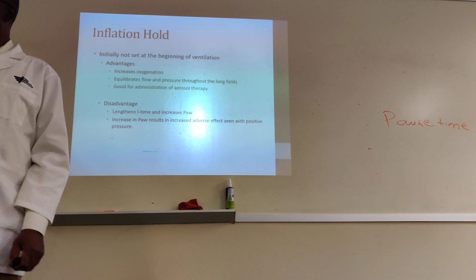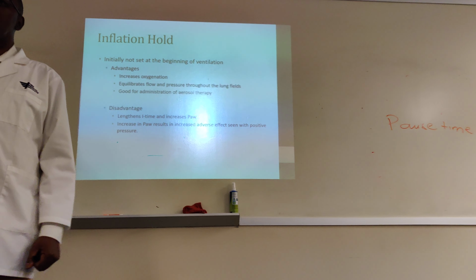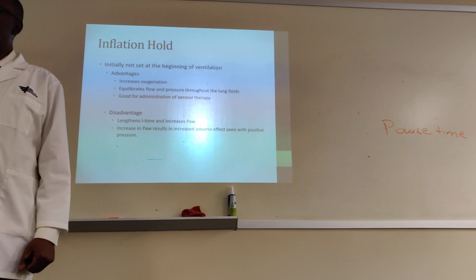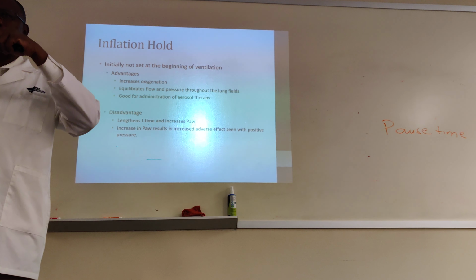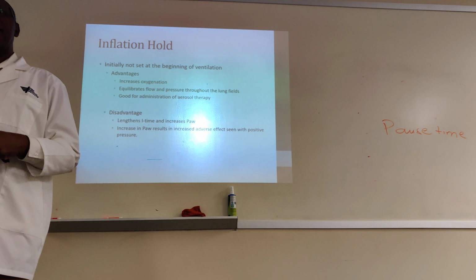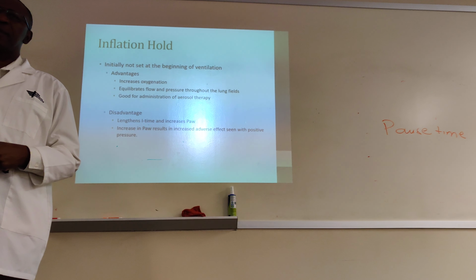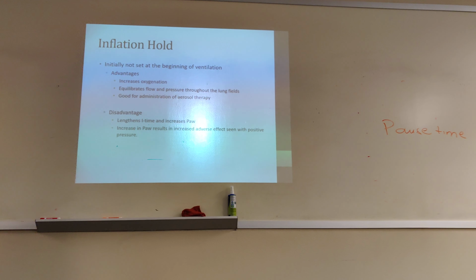So if you did inspiratory pause, you would only do it one time. But you can actually go inside the parameter screen and set it there. If you set it there, from breath to breath, the patient will hold their breath. It has advantages.